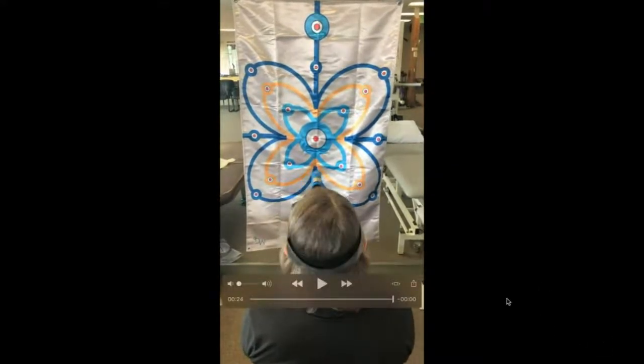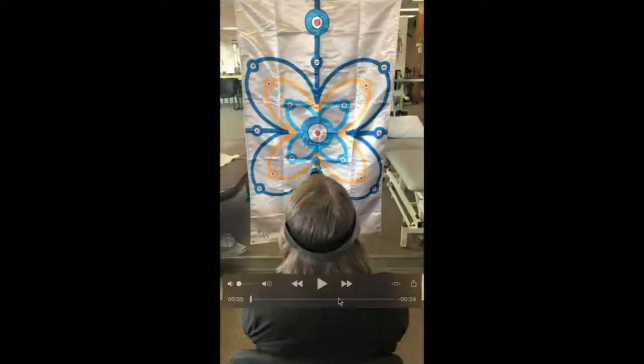All right, so let's play that again and let's break this down a little bit. A couple things that you might have noticed when we're doing this, distance measurements. I actually haven't ironed out the folds in my flags. I've noticed that it actually gives me another distance measurement that I can see very easily, although these iron out pretty quickly on low heat, if you have that personality type, I guess.